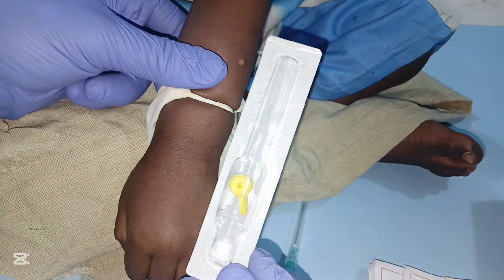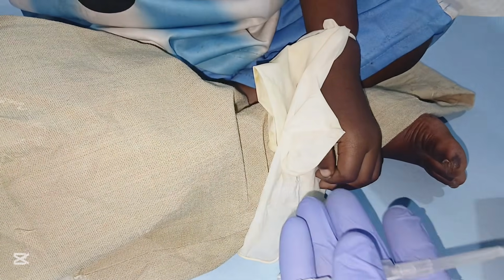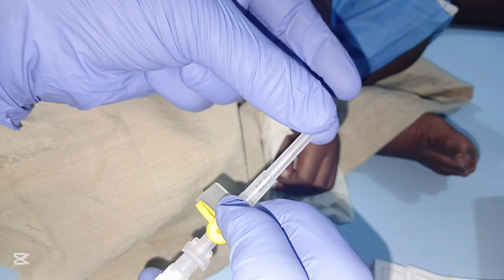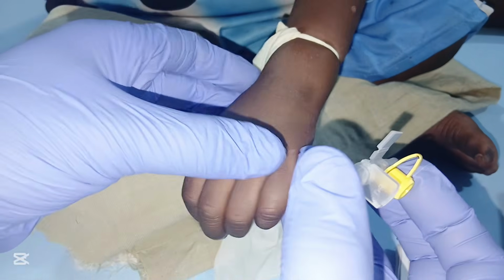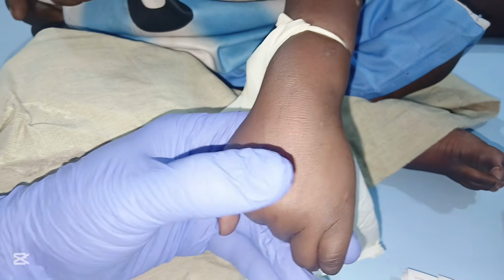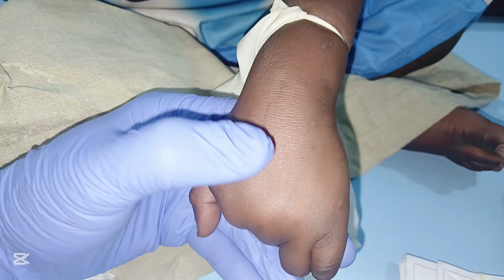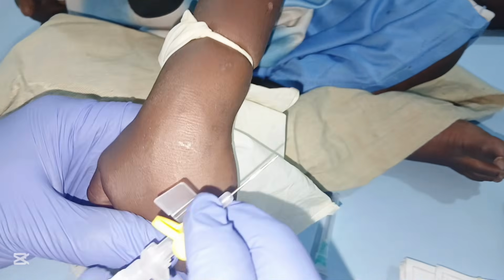Then you get the IV cannula. Make sure you unpack the cannula from its packaging. Then you attach the cannula in position for flexibility. Then make sure you remove the cap of the cannula. You get the child's hand. Make sure you use your non-dominant hand, that is the left hand, and your thumb will always be there to support you when you are performing the IV insertion, because it will help you to retract back the skin for easier placement of the IV insertion.